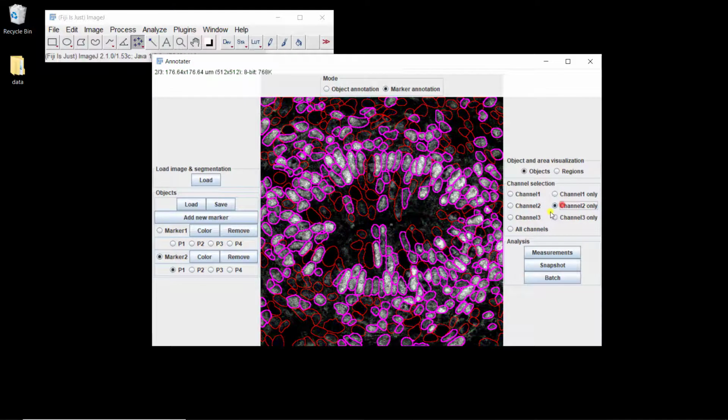If I look, so maybe it was too much. At the same time, I think no, I think it was not enough. So you can correct it then and add some that you think should be there too. Yeah, here it's tricky maybe. It's not that easy in that particular case. Maybe this one. Of course, you can do the reverse if you think that you got one that shouldn't be there. Like I don't know, this one. It's not positive. You can remove it. You can put it back.